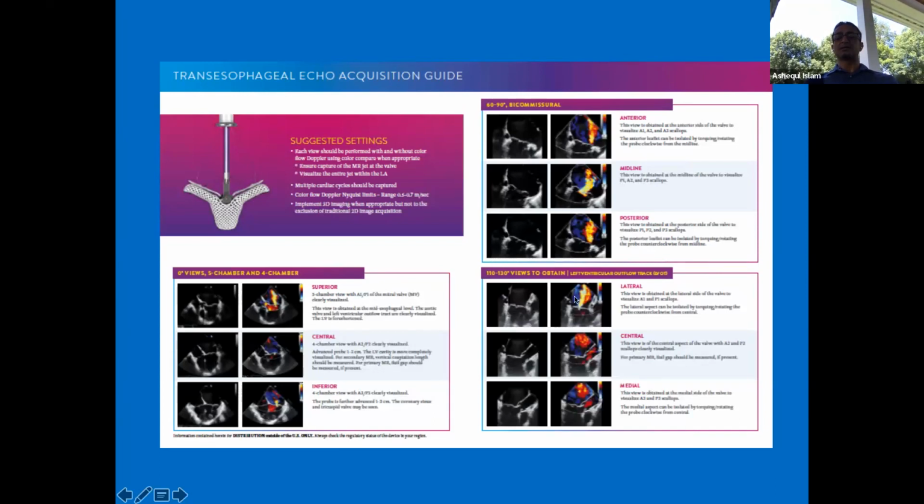And the beautiful thing is you'll be able to assess both at the midline, 60 to 90 degrees plus somewhere like this in the long axis view, which is often called the LVOT view, because that's exactly how it looks like on transthoracic echo, LVOT, that you obtain the mitral valve and the aortic valve both visualized. And in that segment, just behind the aortic valve is the A2, and posteriorly you have the P2.